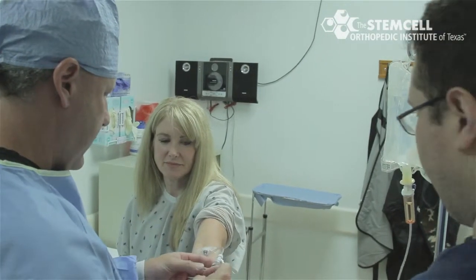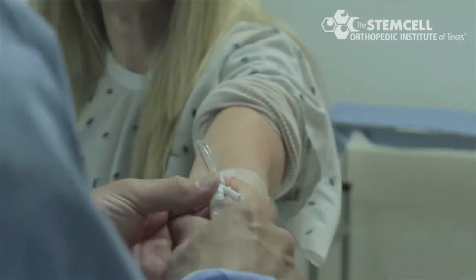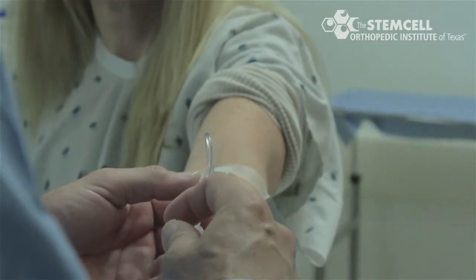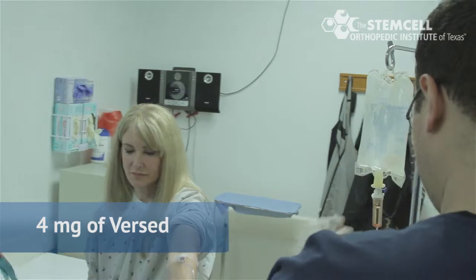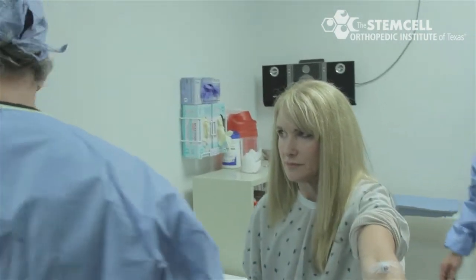The patient is taken back to the room where she'll be seated on the table. An IV is started in the antecubital fossa through which to give sedation. She'll be sedated with four milligrams of Versed, which relieves the patient's anxiety and makes the procedure very tolerable with a modest amount of sedation.